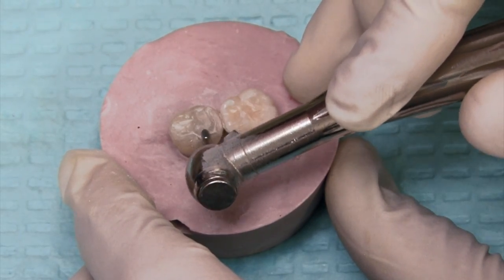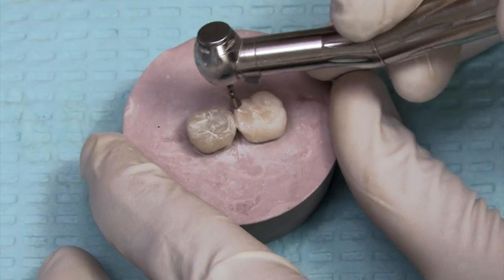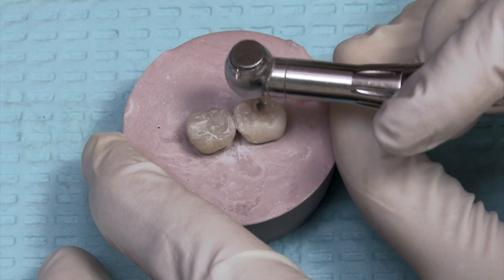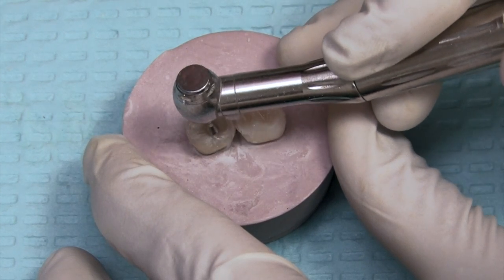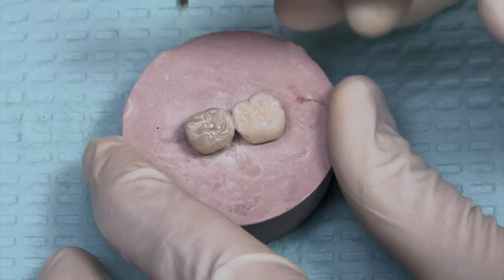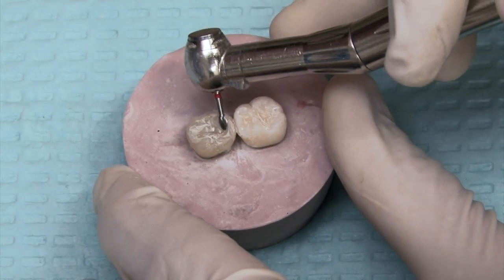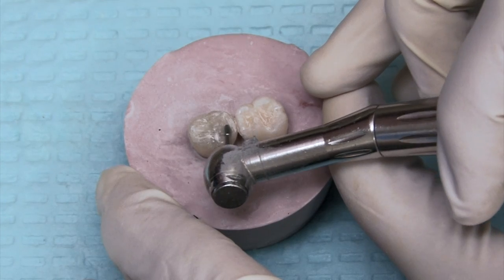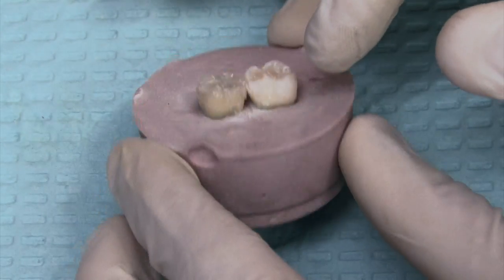As an optional step, you can use a burr similar to those we used on amalgams to shape more distinct pits and grooves. I'll put that right where the main pit of the tooth is and then radiate from that point, moving along where other grooves are and going up the buccal and lingual grooves, recreating the anatomy of the tooth. But I always follow that back up again with the football finishing burr, because even though I want to reestablish the pits and grooves, I don't want anything too well-defined — patients would rather have something smooth and more cleansable. So I'll refine that and work out the sharper areas to make it more smooth.